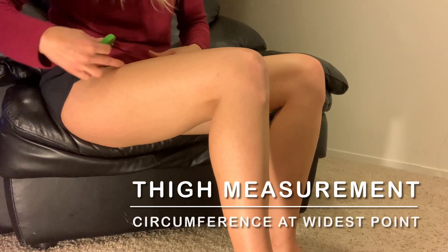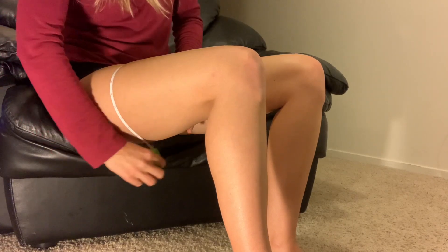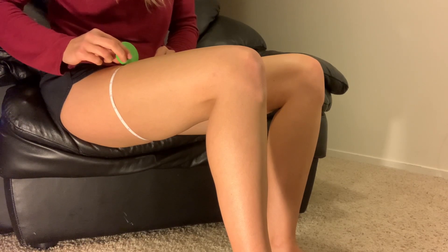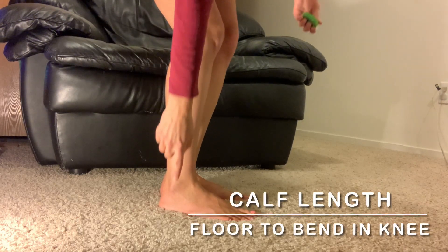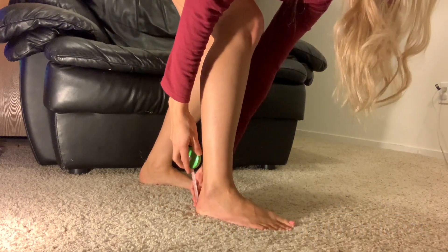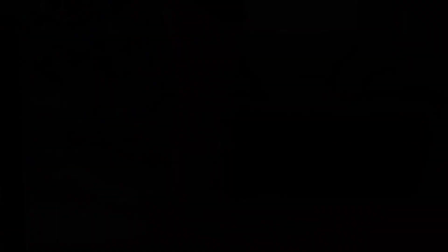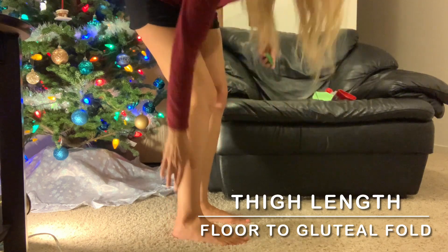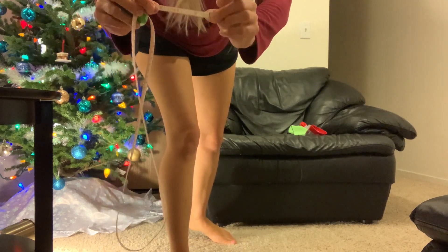For the thigh, you're going to measure around the widest part of the thigh. For a knee-high compression sock, you're going to measure the length from the floor up to the bend of the knee — from the back of the foot up to the back of the knee. For a thigh-high compression sock, you're going to measure the length from the floor up to the gluteal fold. The nice thing about this measuring tape is there is a little extra room so you can anchor it under your foot if you are doing this yourself.